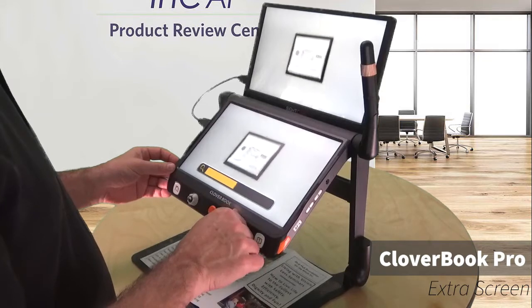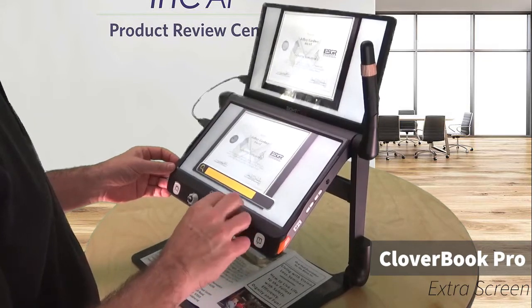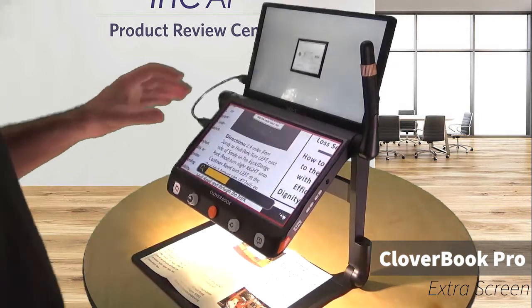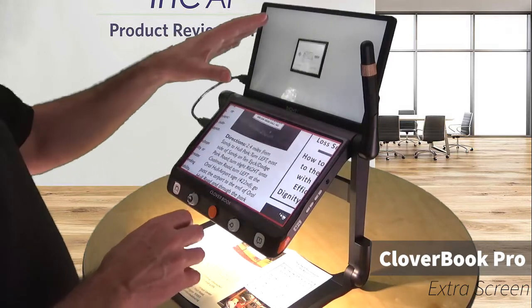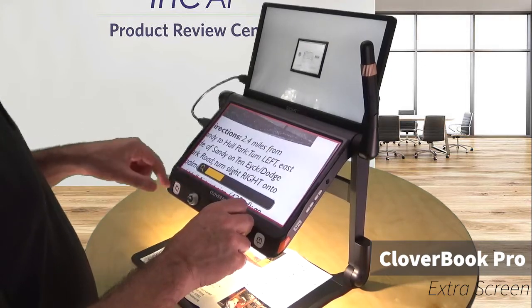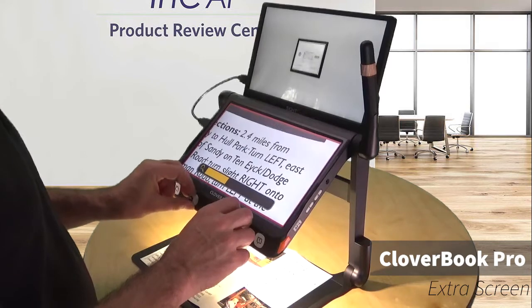I can zoom in on that. Maybe I can get in close enough you can see it. And if I hit it again, I'm actually going to get each image on a different screen. So now I have my distance cam, I have my close cam, and the one that's closest to me, I can control everything still here, change the contrast, do everything I want to do.